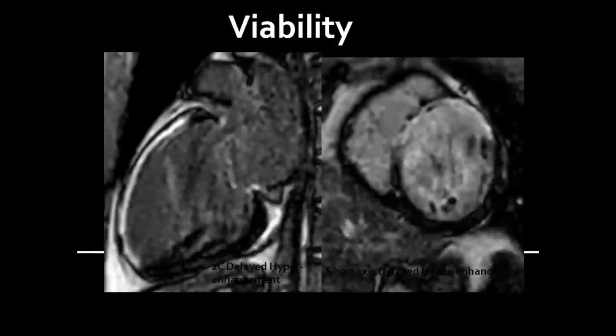So what if someone insisted, who doesn't think about the importance of viability, believed in the open artery hypothesis, like, oh, I would increase the stability and the electrical stability of whatever. And he insisted on doing a PCI for this patient. Here's another important finding by MRI: you see this no signal or hypo-intense area within this scar, and this represents a microvascular obstruction (MVO). That is explained in the coronary angiography by the nightmare of no-reflow phenomenon.